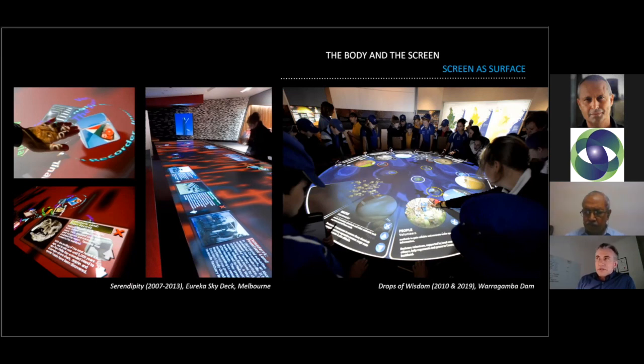We worked with the company that developed the PlayStation iToy to develop a multi-camera tracking system that could detect where people were touching on the surface.